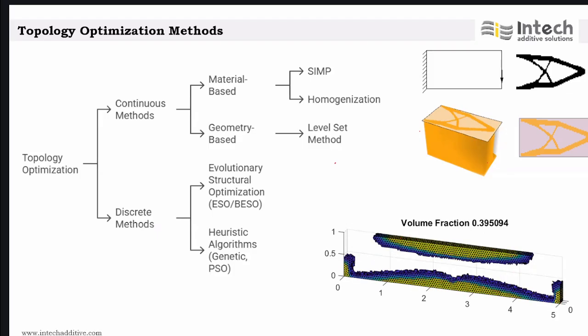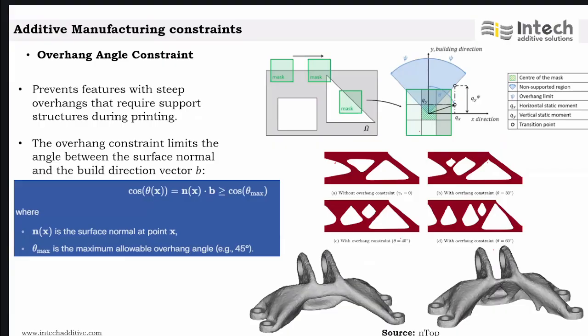Predict is also a method which can be called from the object of the class K neighbors classifier. So there are different constraints pertaining to the additive manufacturing process. Like you have overhang constraints here.